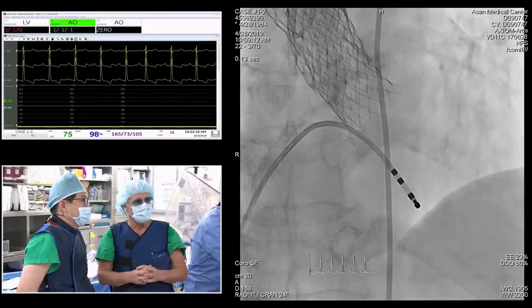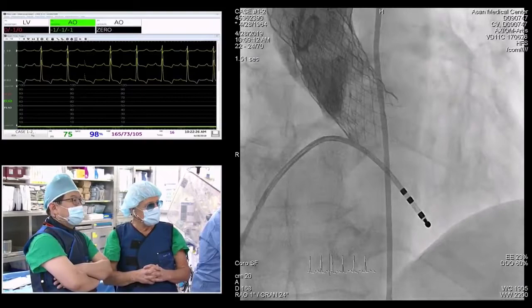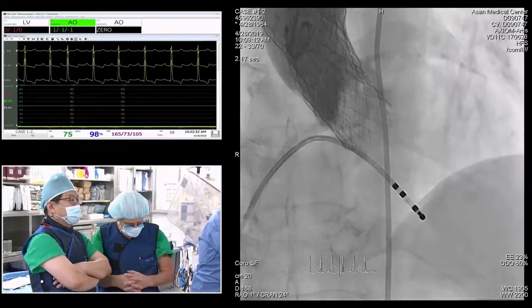Great. Eberhard, this was a very challenging case, so congratulations to both of you. Clearly there's perfusion. This patient had very severe aortic stenosis and is obviously much improved now. We always try to look back in retrospect and ask what we might have done differently. There's such a fine line between not wanting to go too deep and increasing the likelihood of heart block, versus being a little high and then you can get embolization. So how do you think this might have been avoided? Would you have done anything different?